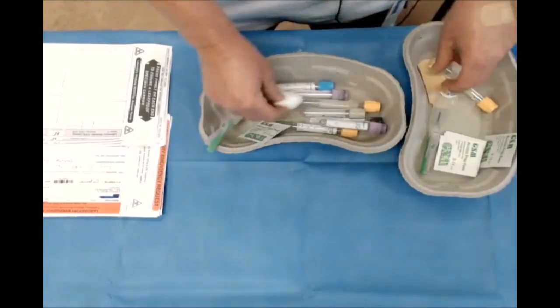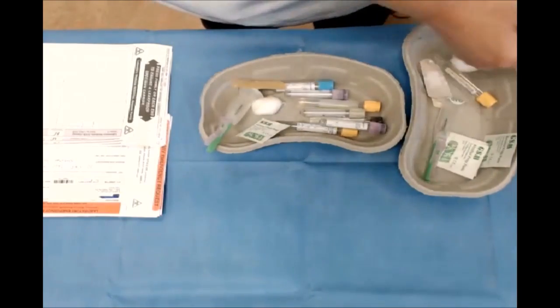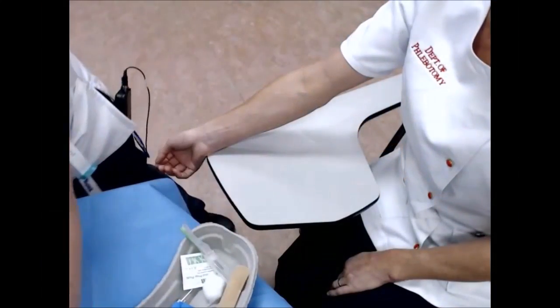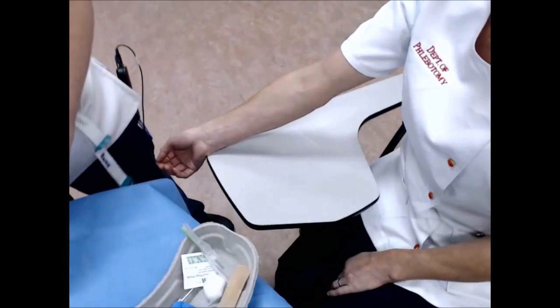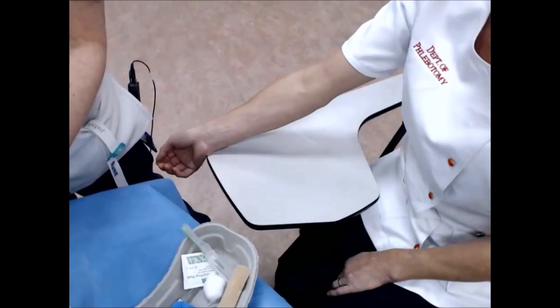I need a swab, cotton wool, a plaster, and a pair of gloves. I'll take these along with the requisition forms to the patient's bedside, along with my labels and alcohol gel that should be at the end of the patient's bedside.